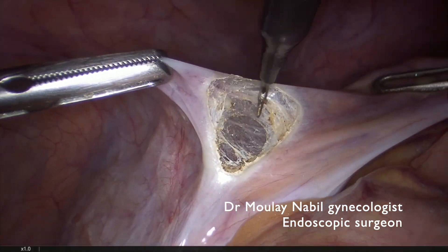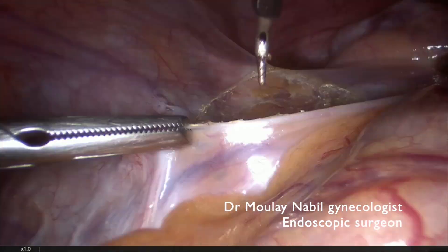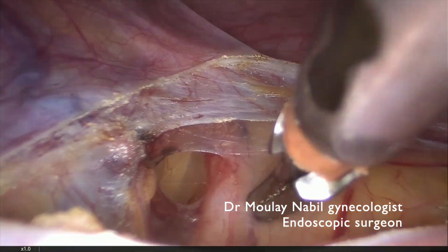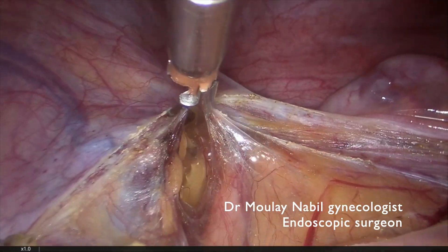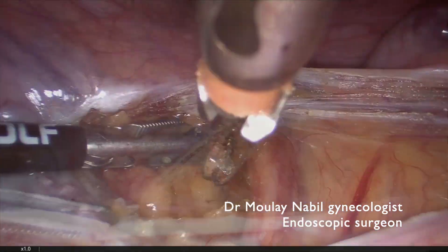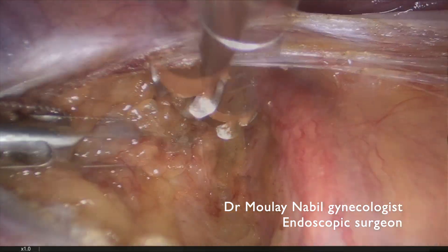We will do the same procedure on the opposite side, opening the peritoneum lateral to the IP ligament to have a good view on the retroperitoneal space. We reach the ureter, we open the space lateral to the ureter, and sometimes the internal iliac artery can be deeper than we think.